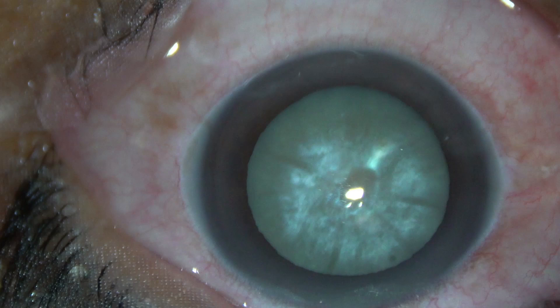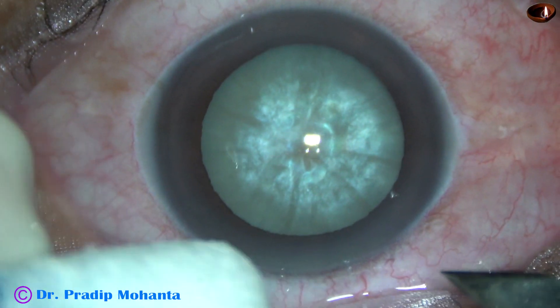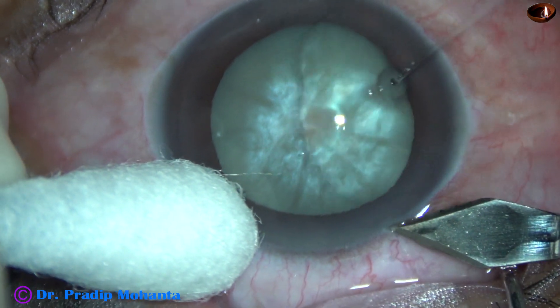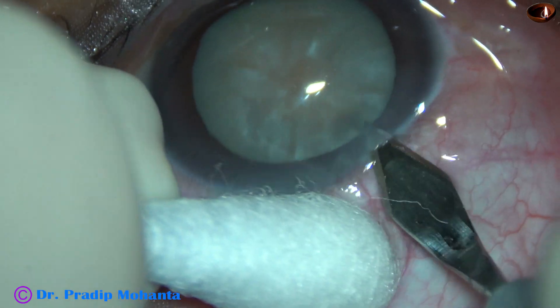Let us observe phacoemulsification of this intumescent cataract. The main incision is placed on the posterior aspect of the limbus with a steel keratome at around 135 degree axis.